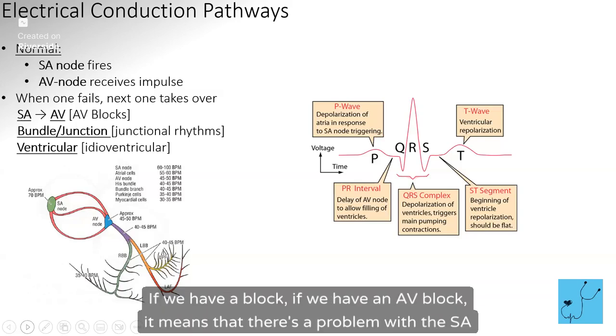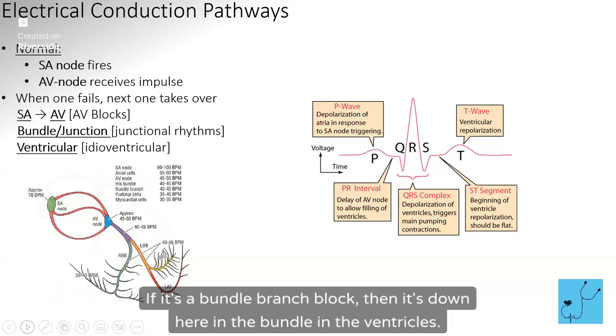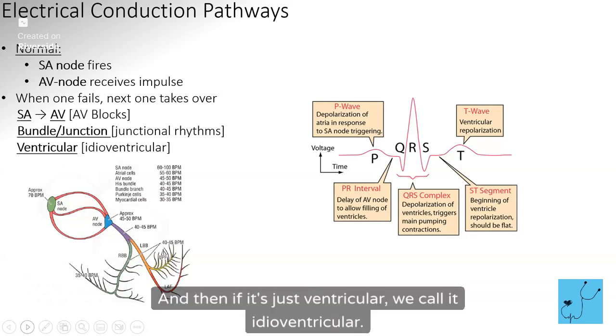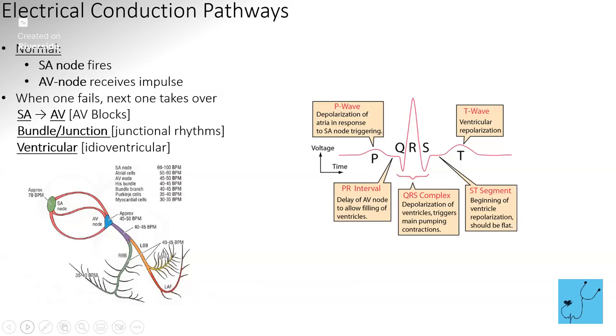If we have a block, if we have an AV block, it means that there's a problem with the SA node getting to the AV node. There's a problem there. If it's a bundle branch block, then it's down here in the bundle in the ventricles, okay? And then if it's just ventricular, we call it idioventricular. Anything idio means there's no cause, there's no reason that we can identify. So we just call it idio. Okay.